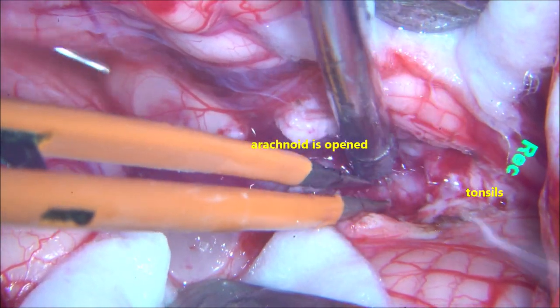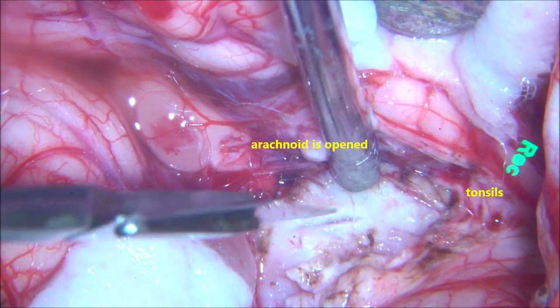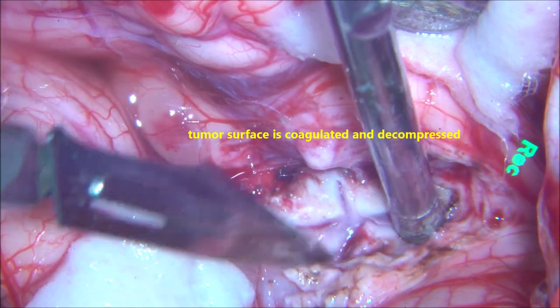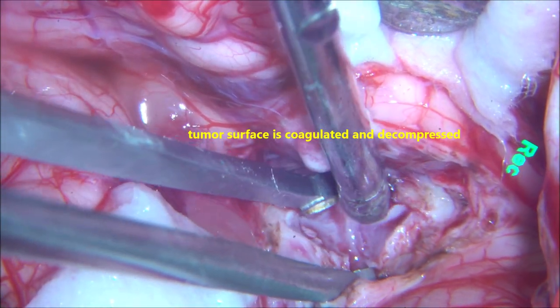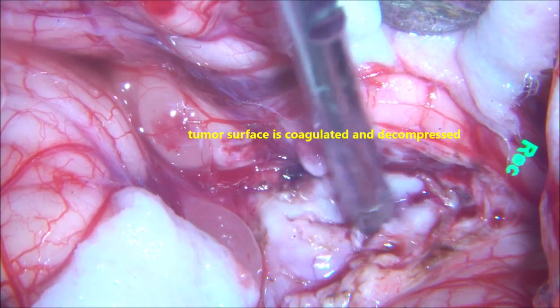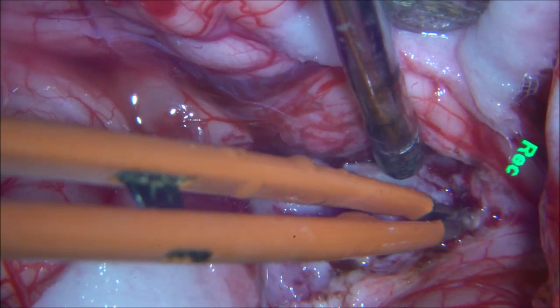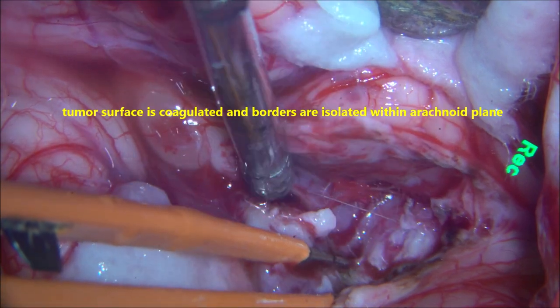The tumour appears quite vascular and firm in consistency. First, devascularisation on the surface and sides needs to be done to allow comfortable and safe resection of the lesion. The capsule of the tumour is opened in a cruciate manner at the lower part, and internal decompression is started. Since the tumour is firm, it does not come into suction easily and appears vascular, so we bring in the ultrasonic surgical aspirator and start decompressing the lesion.